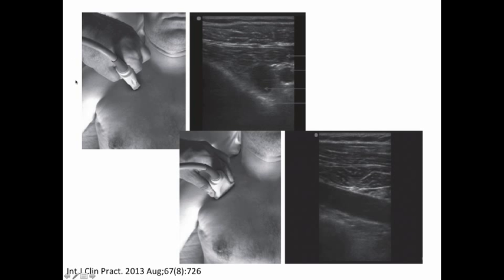I think that the easiest way to do this is to start off by looking at it in short axis view. So remember the vein courses through the axilla and under the clavicle in this direction, so short axis would be oriented like this. What you see here is going to be the vein, which lies closer to the clavicle here versus the artery here.